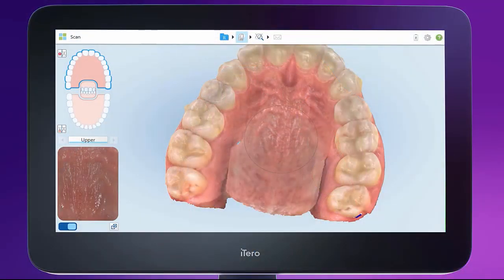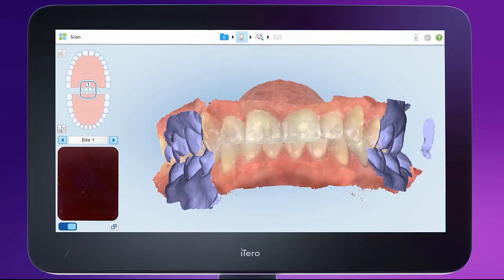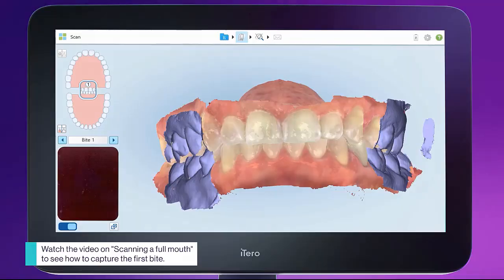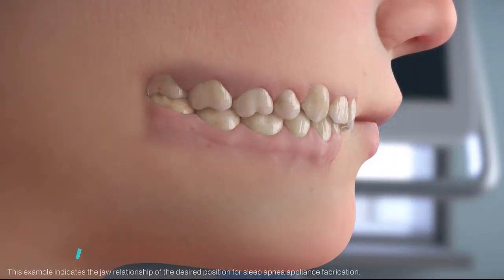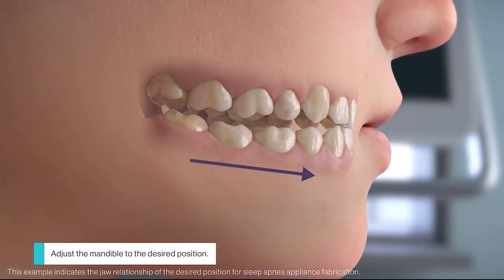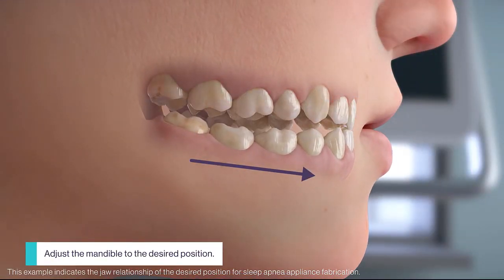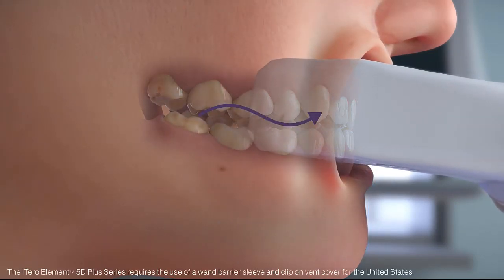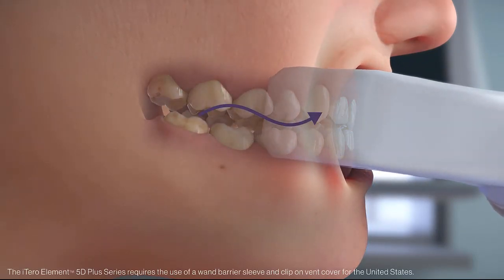Follow the palatal vault with the wand when scanning. The first bite was captured previously, so you can now move to the second bite by tapping on the directional arrows. For the second bite registration, instruct your patient to adjust the mandible to the desired position, then scan the second bite.